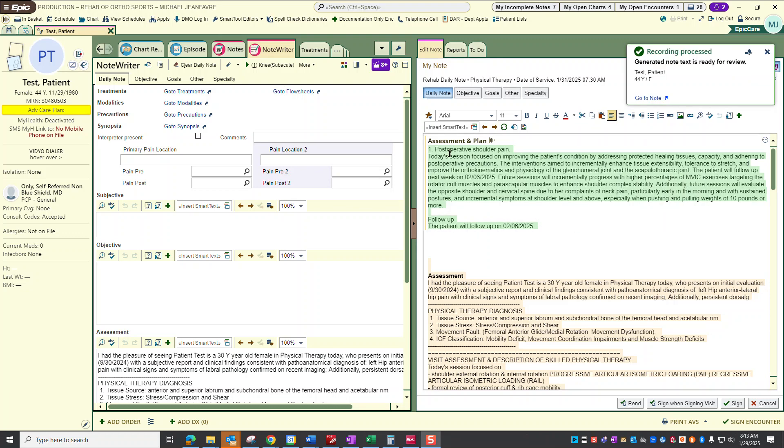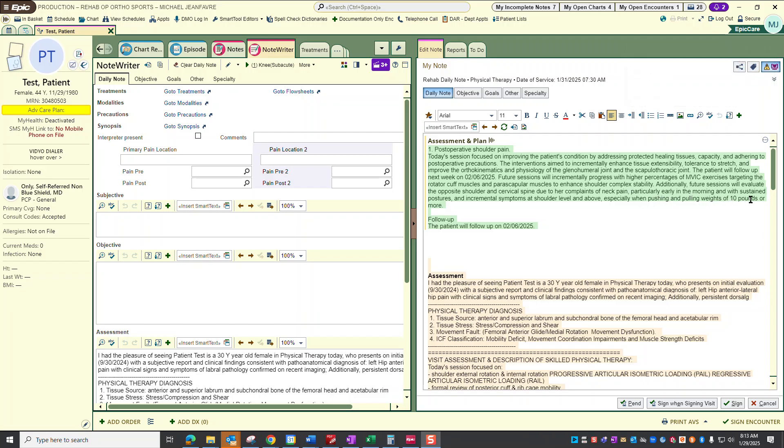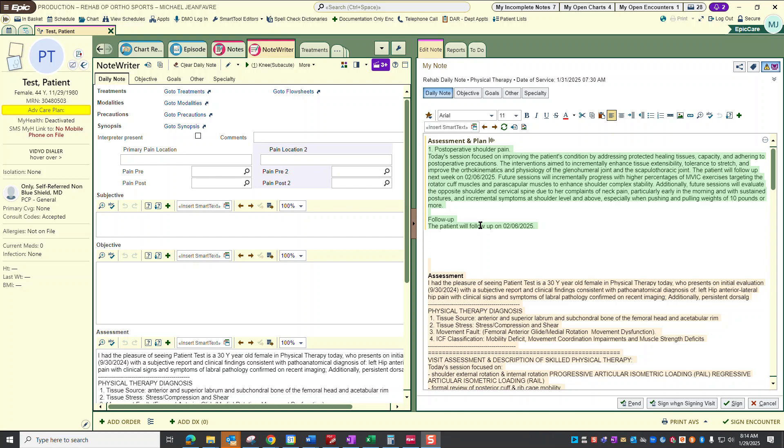And then it regenerates and you can see that it turns green again. Thus we've reestablished the connection and you can see that that information has populated at the end of my assessment. So to summarize, you can copy it forward. If you haven't dictated anything into the note and you haven't pre-phrased anything, you can manipulate, i.e., delete the previous note's information, and the link holds.